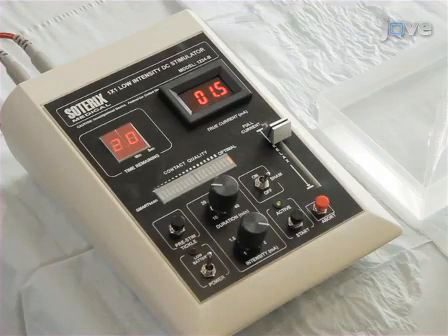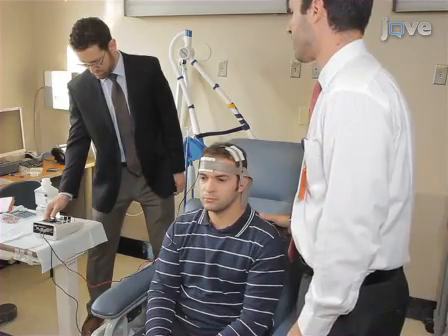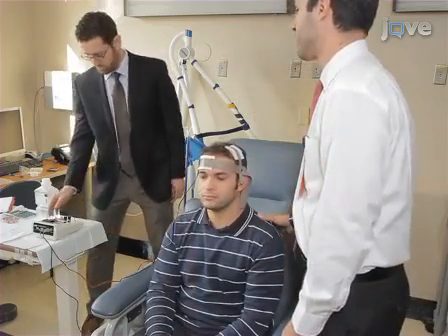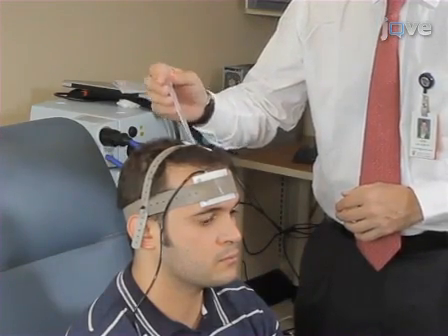In such cases, the current may be moderately decreased for a temporary period, for example by 50%, as the subject adjusts, then gradually increased back up to the desired level. Assure the subject remains comfortable, and be sure to watch for sponge movement and dehydration during stimulation. Use a syringe or a pipette to add more solution if needed through the course of the experiment.